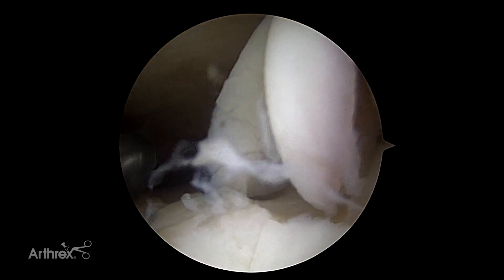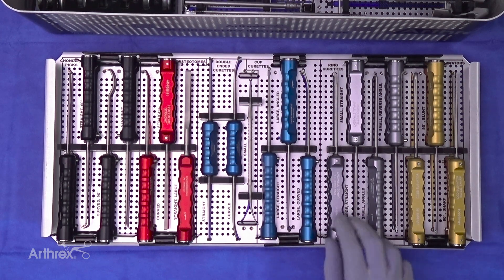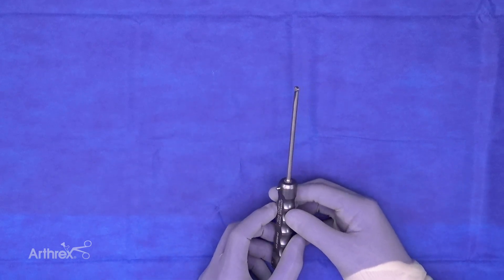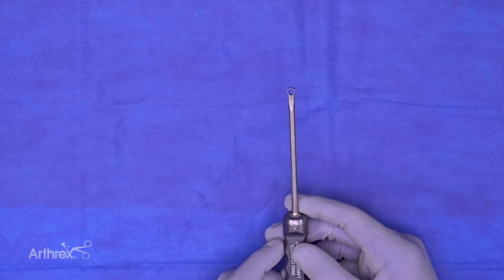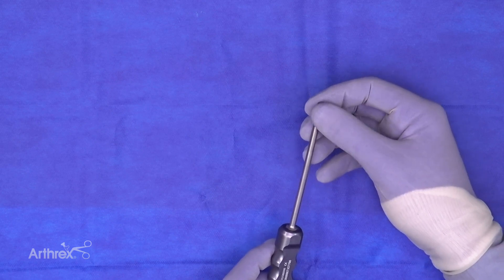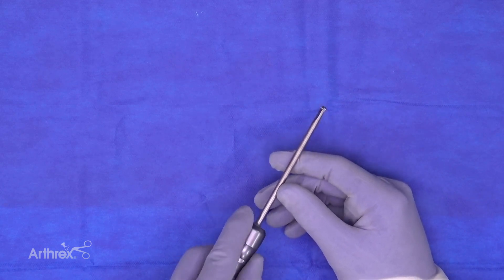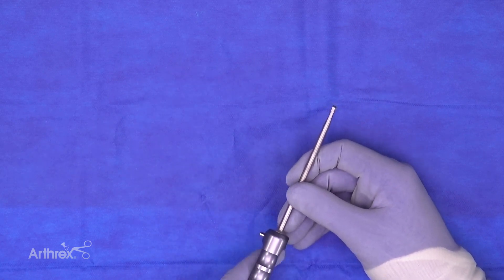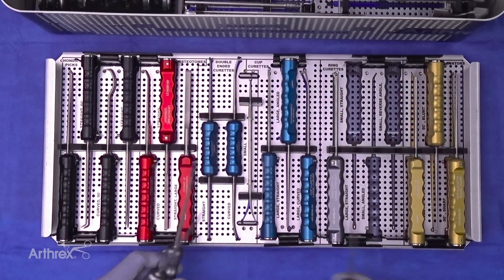Shifting to our silver-handled ring curettes: we have a large ring curette where only one side is cutting, because the head is so large and thick. This is especially helpful when working in a tight joint — for example, debriding the talar dome without inadvertently cutting the cartilage of the distal tibia.